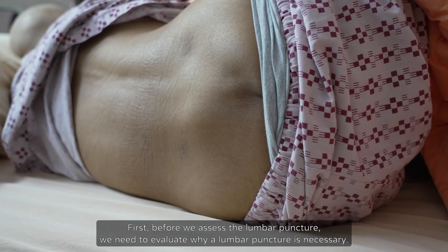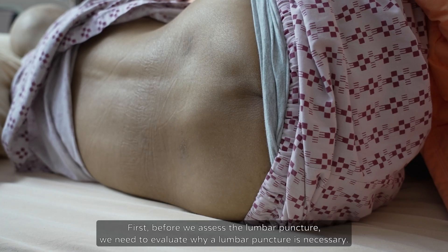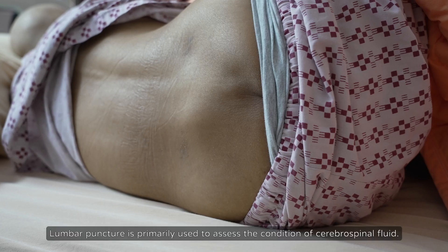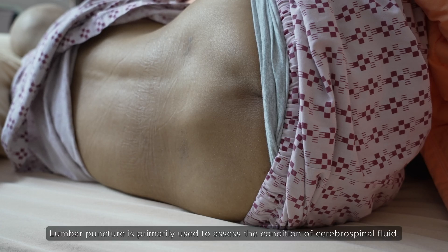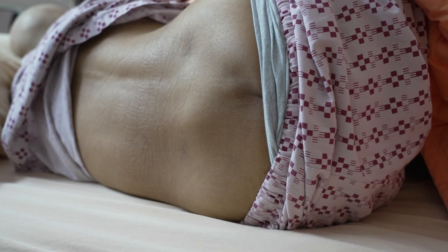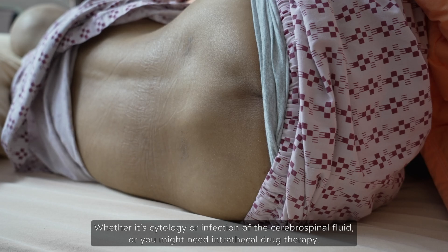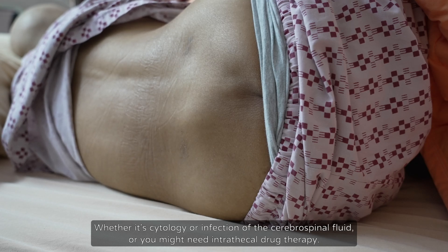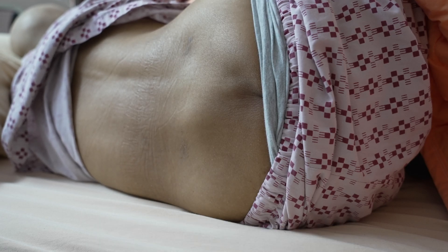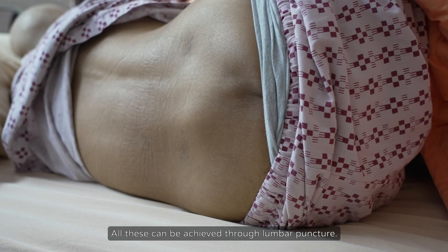Before we assess the lumbar puncture, we need to evaluate why a lumbar puncture is necessary. Lumbar puncture is primarily used to assess the condition of cerebrospinal fluid — whether it's cytology or infection of the cerebrospinal fluid, or you might need intrathecal drug therapy. All these can be achieved through lumbar puncture.